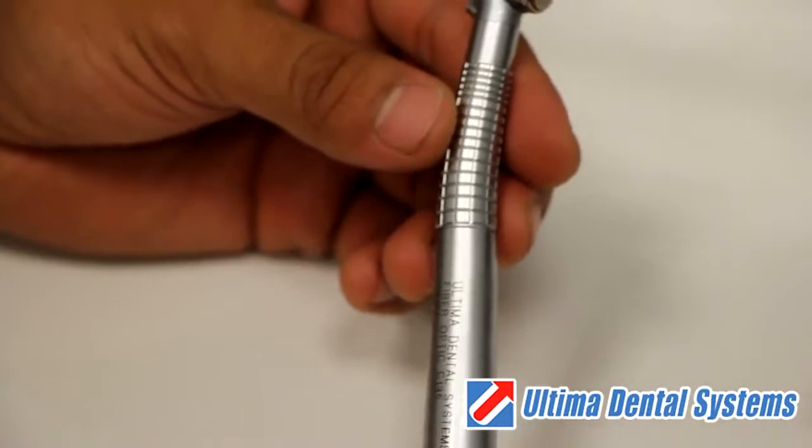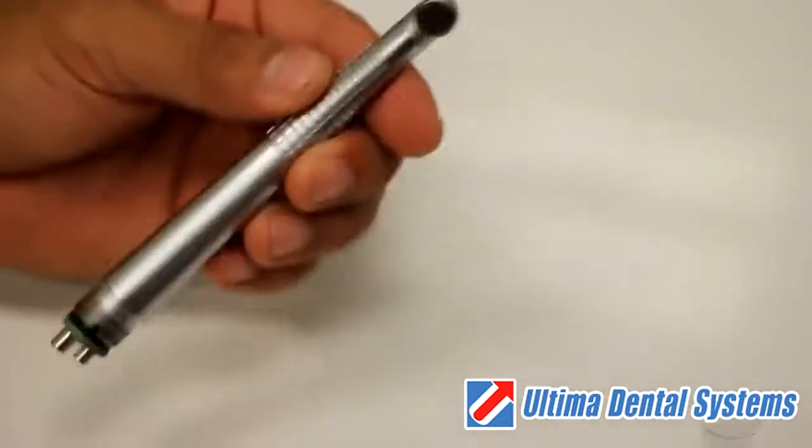First, you should have a burr or a blank seated in the handpiece before starting.